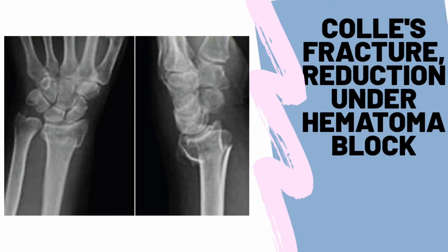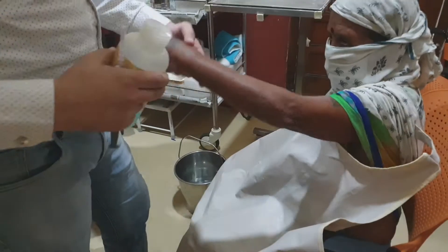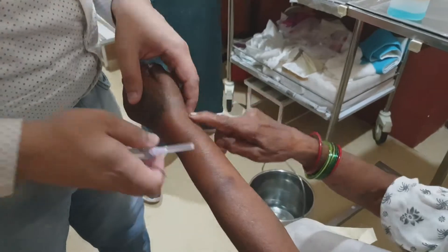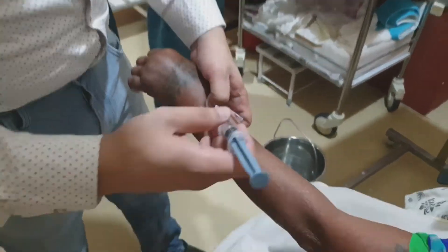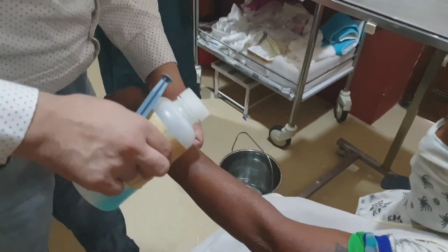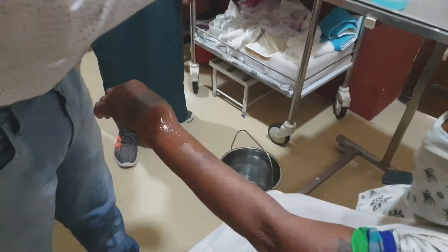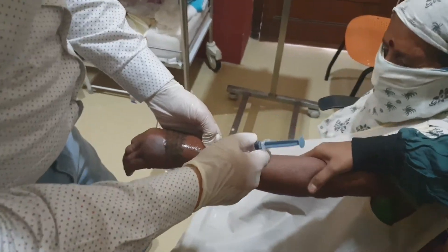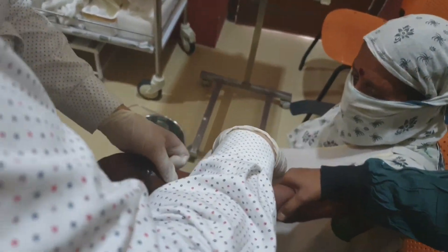Hello everyone, today we are demonstrating a reduction of distal radius extra-articular Colles' fracture under hematoma block. To give a hematoma block, locate the fracture site — you can quite easily locate it — and after locating the fracture site, you can insert the needle from either the radial direction or the dorsal direction into the fracture site.